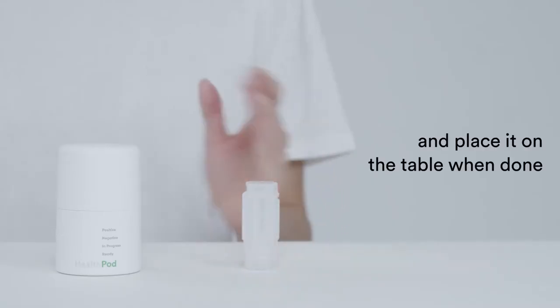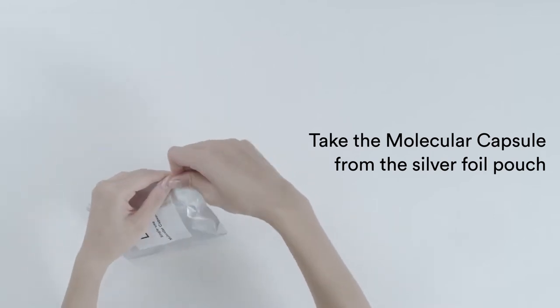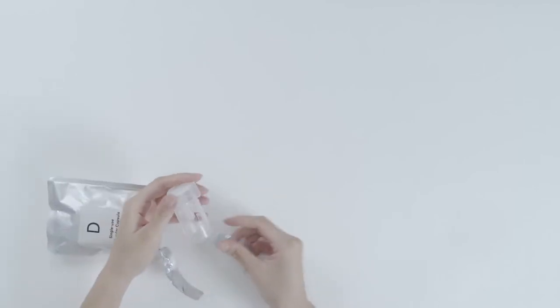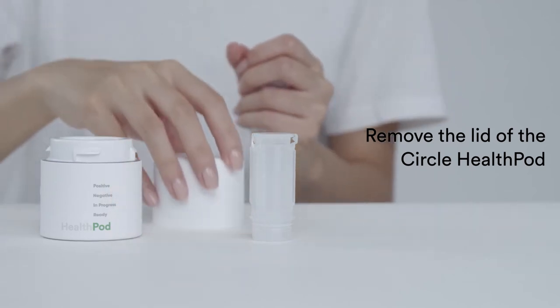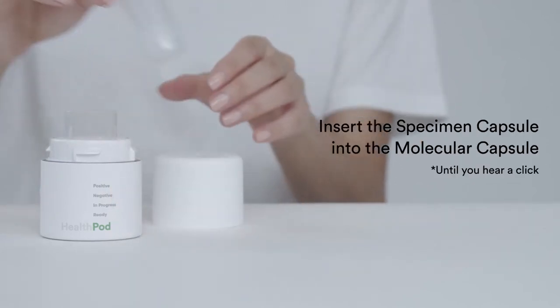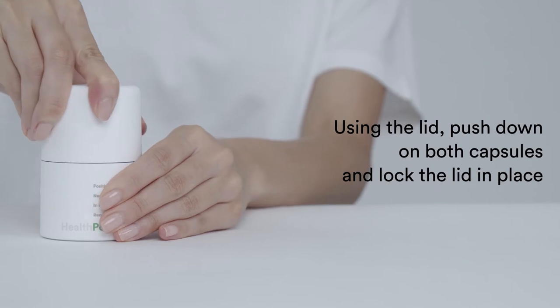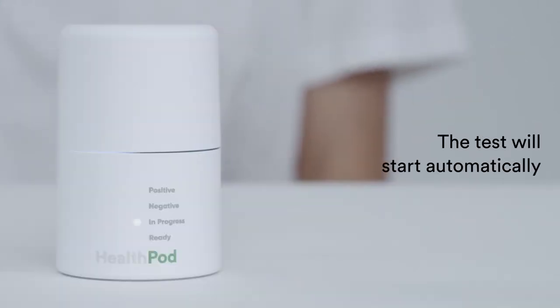Place it on the table when done. Take the molecular capsule from the silver foil pouch. Remove the lid off the Circle HealthPod and insert the molecular capsule in. Insert the specimen capsule into the molecular capsule until you hear a click. Using the lid, push down on both capsules and lock the lid in place. The test will start automatically.